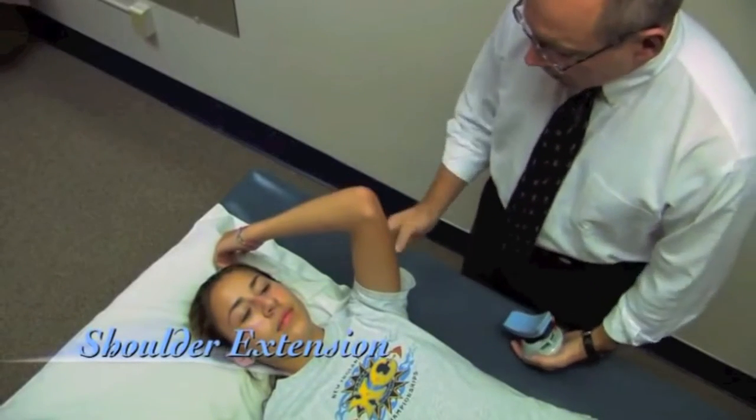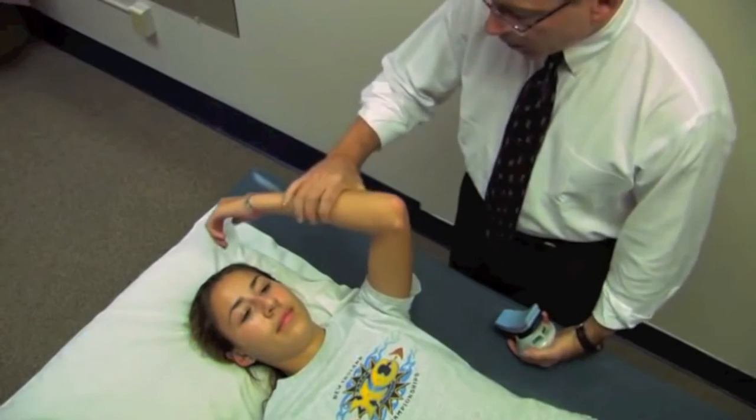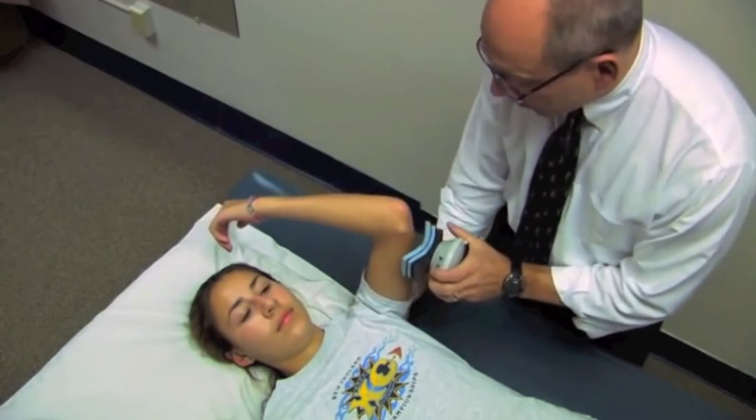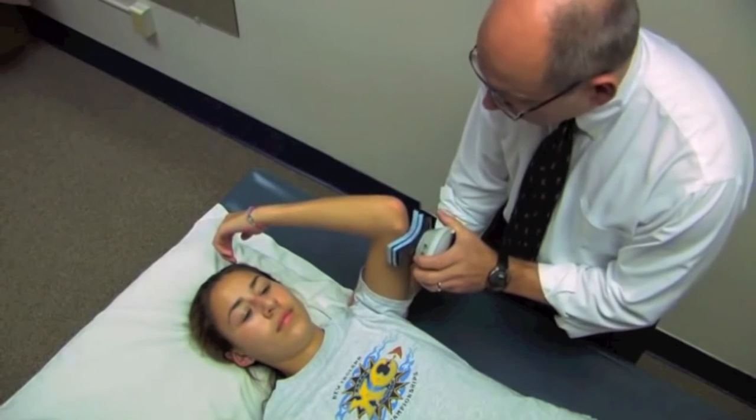Now we're going to measure shoulder extension. The shoulders are at 90 degrees and we're going to allow our elbow to flex. I'm going to place the device just proximal to the elbow and stabilize here. When I say go, take a second or two to come to your maximum effort, then drive your arm down as hard as you can.